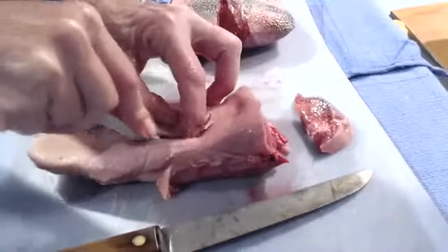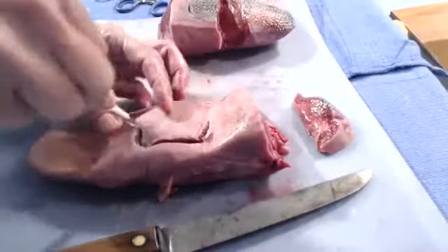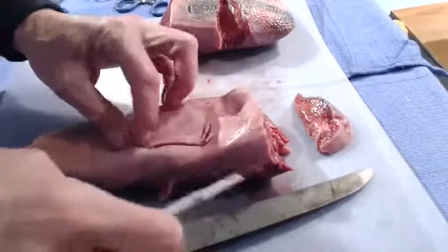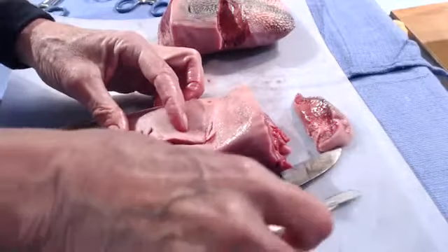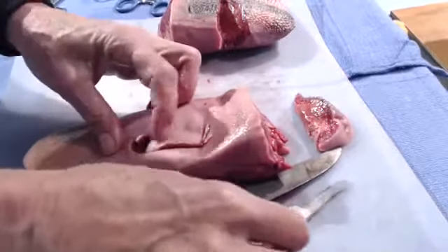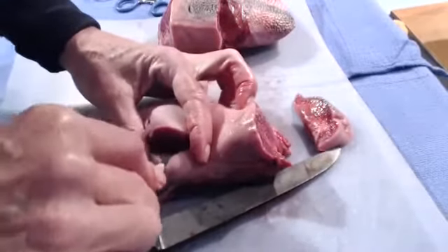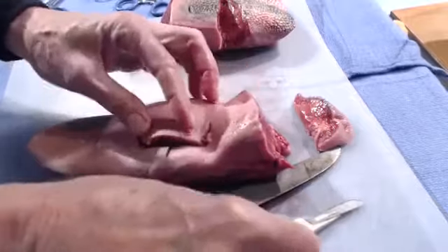And the important thing for this is that it really can be very challenging to see what the anatomy is when you're using a model that was made from a beef tongue. So you have to have a good imagination or have somebody help you get oriented. So we'll make these funky little tears. I'm going to make a funky little midline in there as well so that she may not have an intact perineum. There we go. We'll just do one little one.